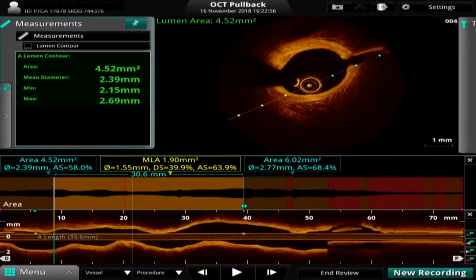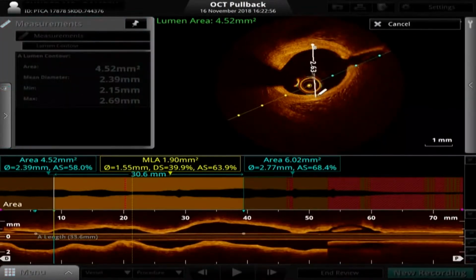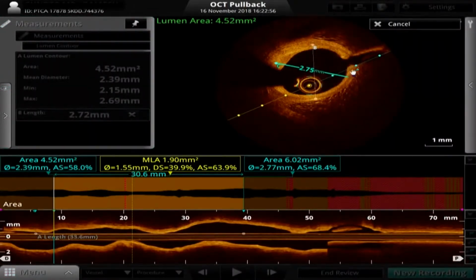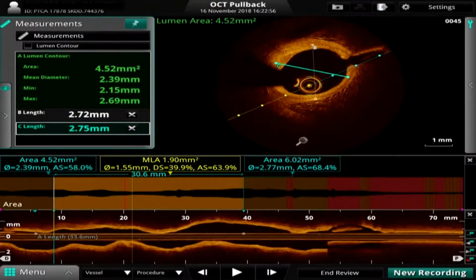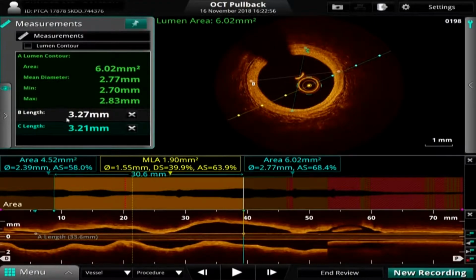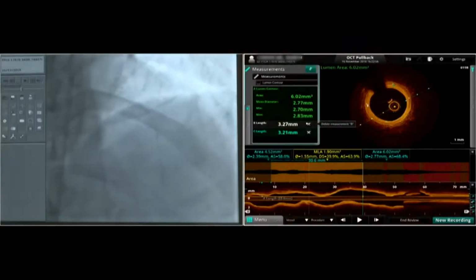Be careful with calculations to, number one, size appropriately, and number two, land in a proper, healthy distal bed. And you'll see in the next lecture, if you do this correctly, you really can accurately place any stent with really very good durable long-term results, I think. And this is what the study we are about to start is going to show.